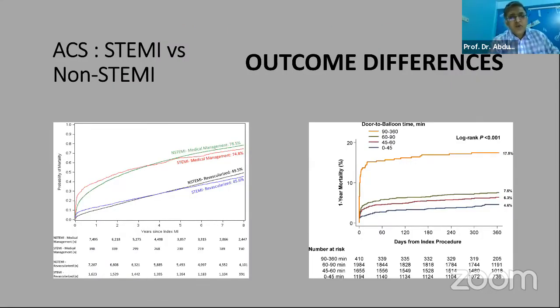Yeah. The ECG that has been shown is actually a reperfusion arrhythmia, and that's actually reassuring. That means the flow has been established. And as Hafiz Bhai was saying, this was actually an idioventricular rhythm. It is a ventricular rhythm that has not reached the level of tachycardia. And we have to just watch, because most of these are self-limiting, and sometimes we just need a little bit of hemodynamic support if the patient is hypotensive. And intervention or revascularization, either by thrombolysis or preferably by PCI, will actually produce good results. That's what he has been showing. Thank you, Hafiz.